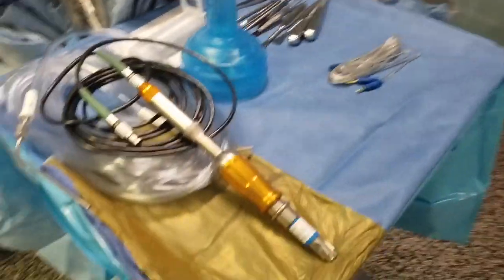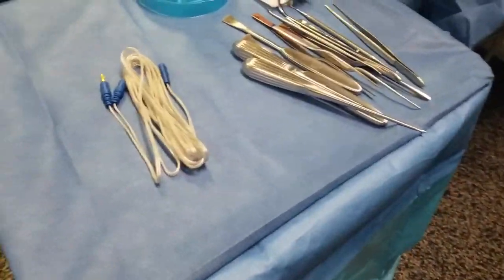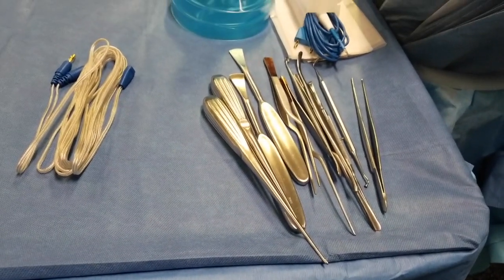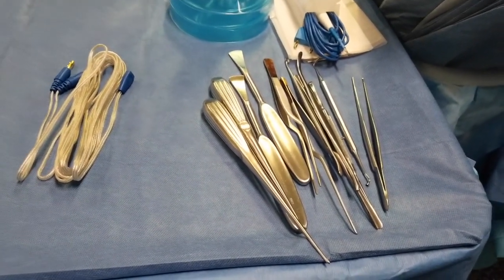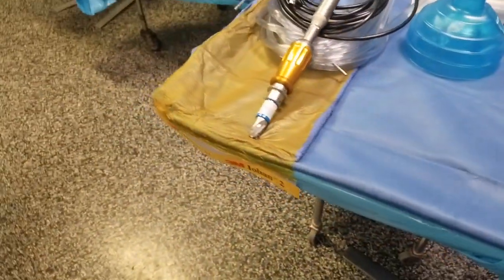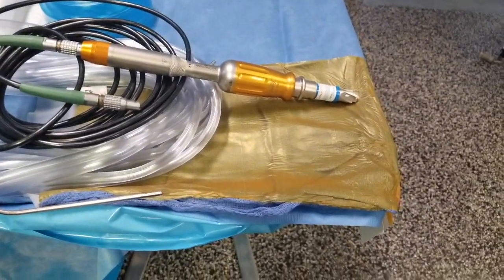My Mayo stand is already set up with the perforator, the suctions, and all the periosteal elevators and bayonets that are going to be used for the surgery. I put a towel on the corner of my Mayo stand with an Ioban drape, which will be for my paddies to keep them wet.